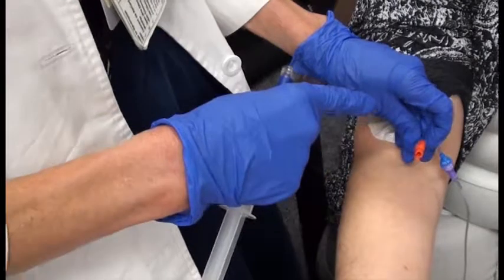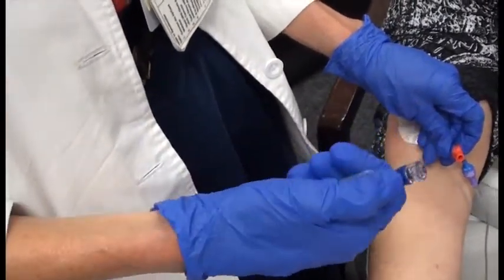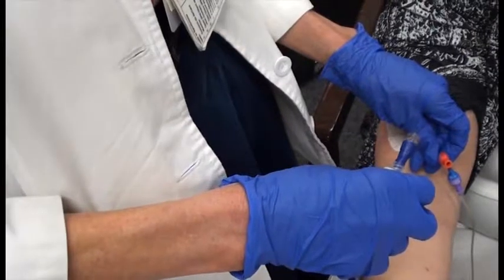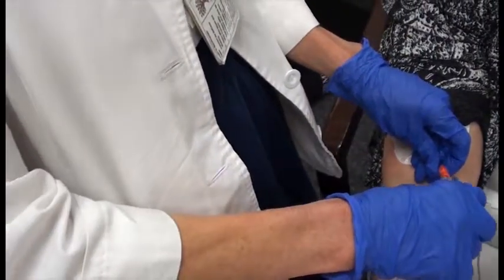This needs to completely dry before you put the new cap on, or else the moisture locks into the cap and then you end up with a cap that won't come off for the next clinician. That's just something I learned last week.